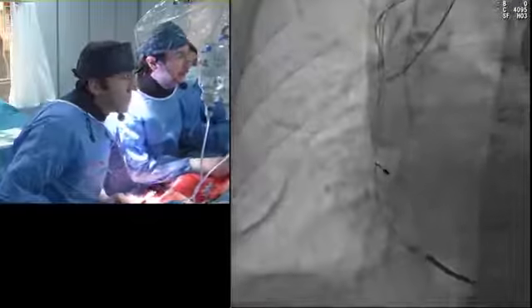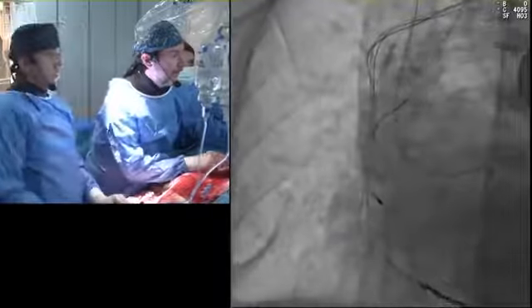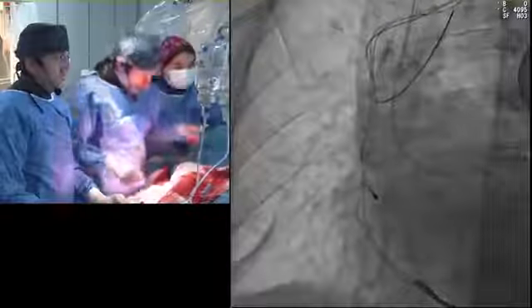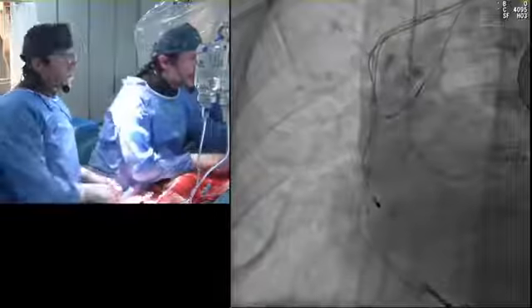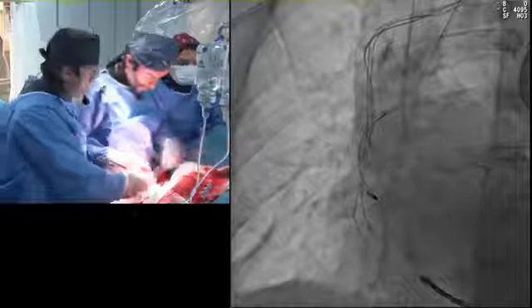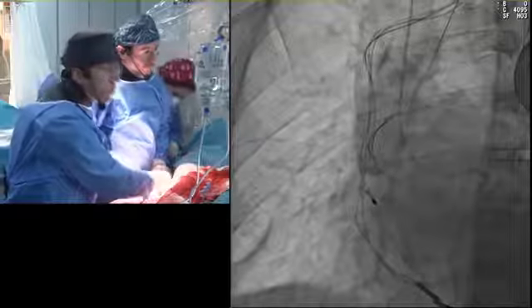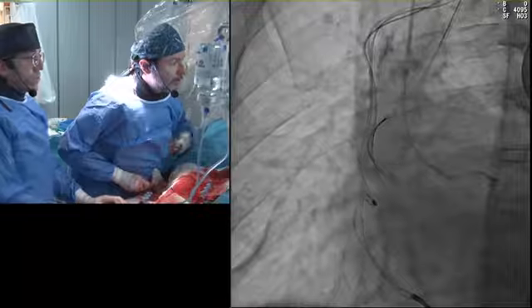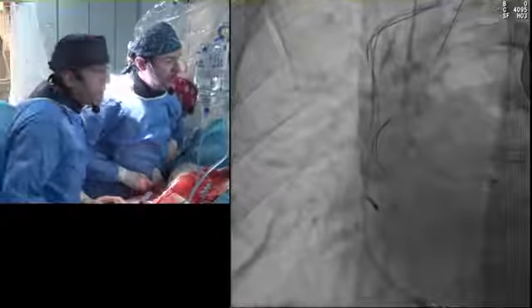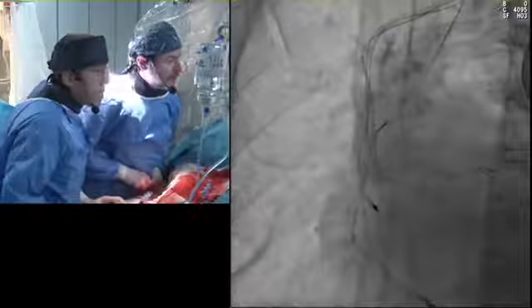One safety approach, we have a paper that's going to come about that technique: you bring a wire from your EBU or XB guide and float it into your left sinus from the donor guide. So whatever traction you do from the other side will prevent your guide from intubating at that same moment. So you protect the ostium whenever you're externalizing.